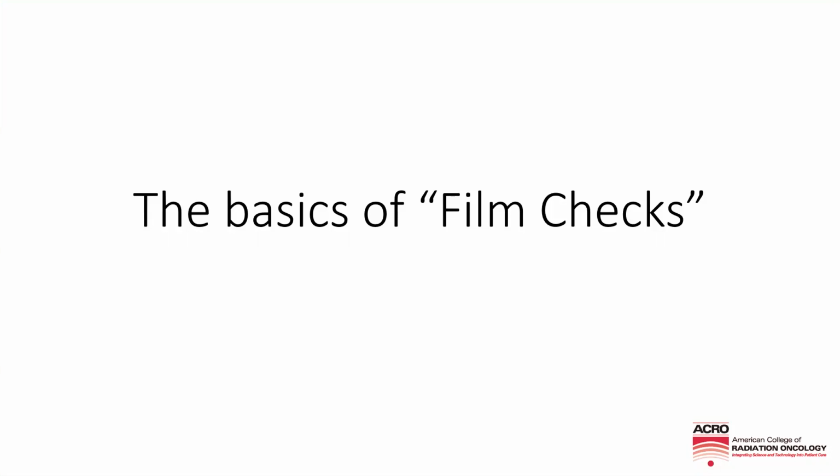Hello, and welcome back to the Acro Educational video series on radiation oncology basics. Today, we're going to look at the imaging techniques that are most commonly used to make sure a patient is in the right place before treatment begins. These techniques form the basis of image-guided radiotherapy, also called IGRT.